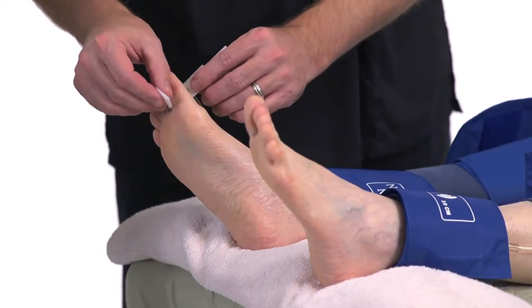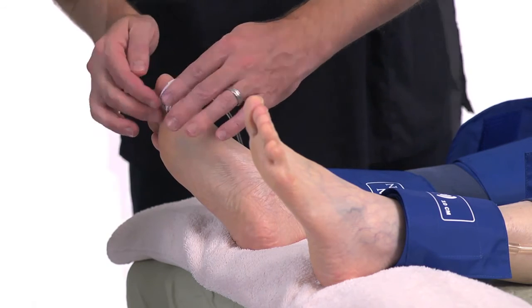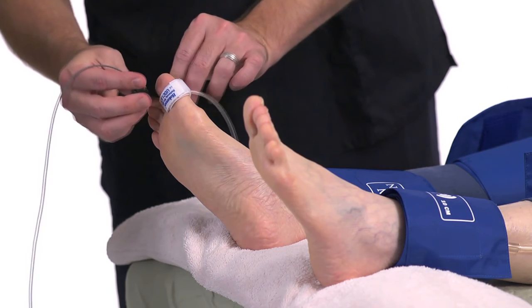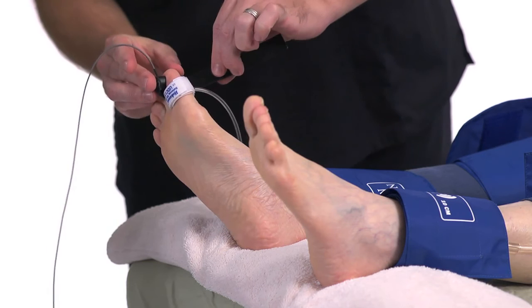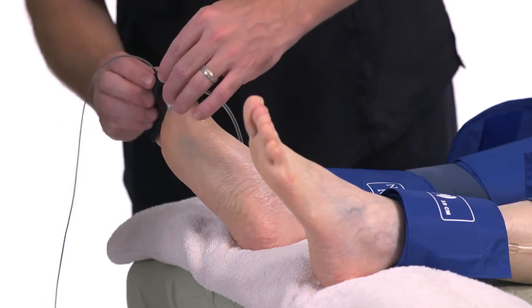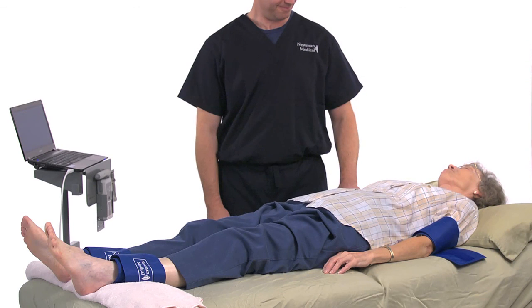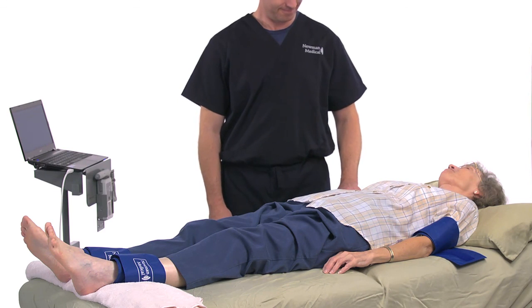A PPG sensor may be used to pick up a pulse in a digit. The Newman Medical PPG sensor is a unique sensitive audio probe that produces a beep for each pulse it detects. The PPG is most often used on the toe along with a digit blood pressure cuff to determine the toe pressure. Wrap the flexible strap around the toe distal to the cuff. It should be snug, but not too tight. It may help to tape down the cord from the PPG sensor to avoid stray signals from patient motion. Let the patient relax for a moment while listening for the audible beep.